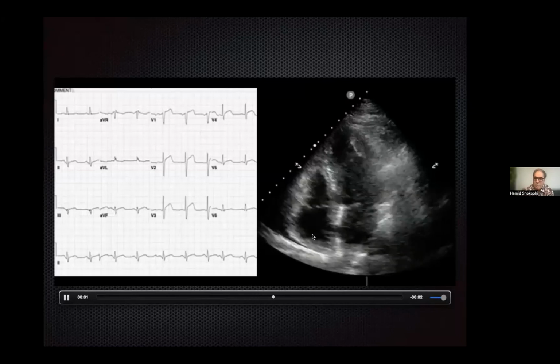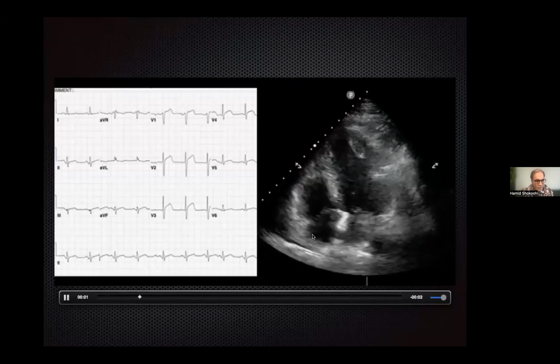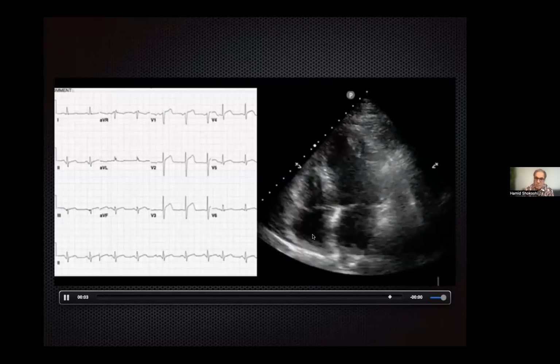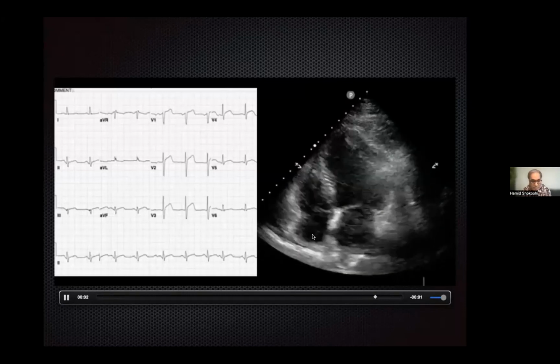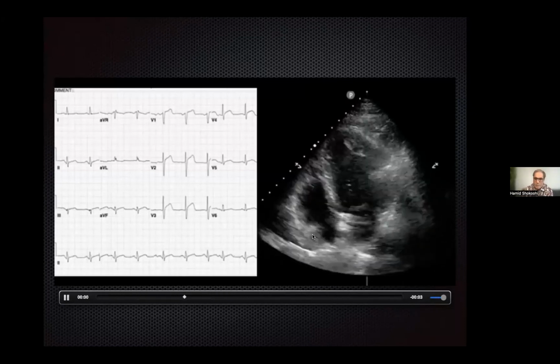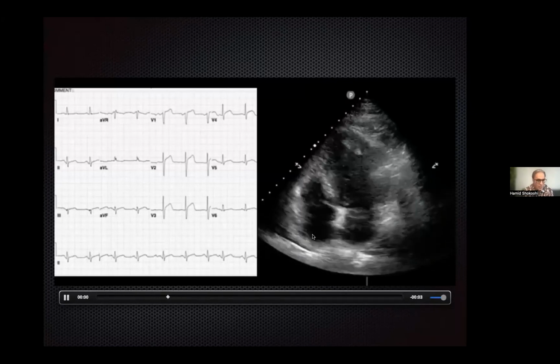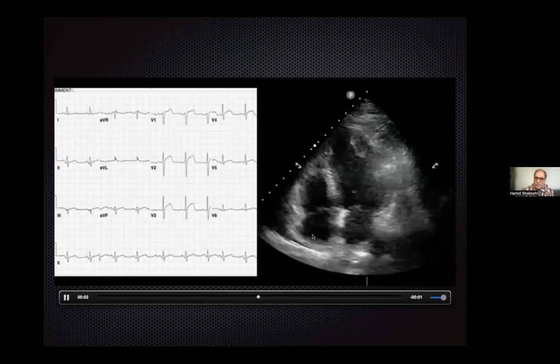Give some time for the patient to have actual movement. This is the epinephrine effect. The other thing is that because the LV has been down, the RV is getting super dilated. That doesn't mean the patient has pulmonary embolism. Those are the two pitfalls we see with the patient with cardiac arrest and shock that you need to consider.